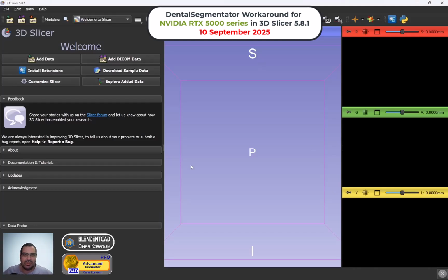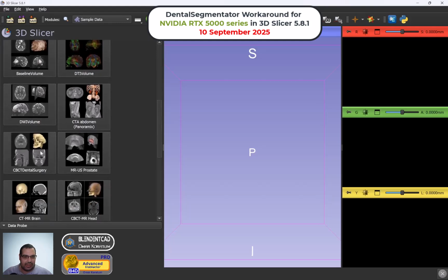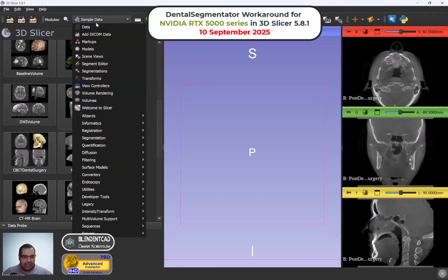Hello everyone. In this video, I'm going to show you how to make DentalSegmentator or any AI segmentation extension in 3D Slicer 5.8 work with the newest NVIDIA RTX 5000 series. So now let me just open a sample CBCT from 3D Slicer.